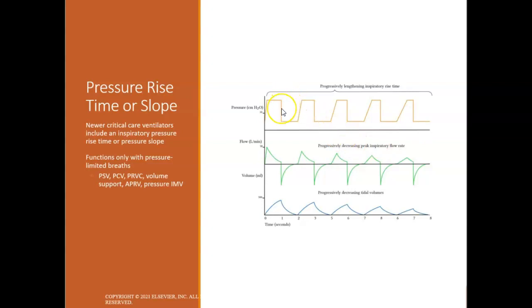So again, I feel like a lot of times we're not monkeying around with this. This could be beneficial to patients if there is really, really high airway resistance, because you're seeing a reduction in volume and a reduction in flow rate. So it can be helpful in overcoming inspiratory airway resistance issues, but that's the only real benefit I can think of.